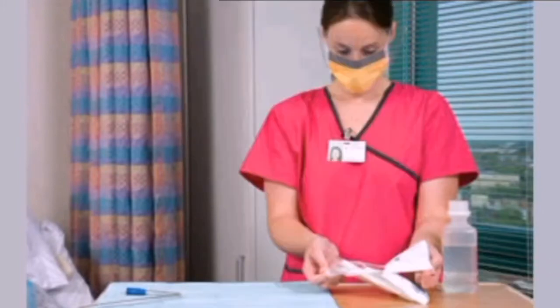Put on your PPE, your face shield or goggles, face mask, and gloves. Now for the cleaning of the tracheostomy, the disposable inner cannula. Carefully open the package with the new disposable inner cannula, taking care not to contaminate the cannula or the inside of the package. Carefully open the package with the sterile cotton tip applicators, taking care not to contaminate them. Open the sterile cap or basin and fill 0.5-inch deep with saline. Open the plastic disposable bag and place within reach on the work surface.